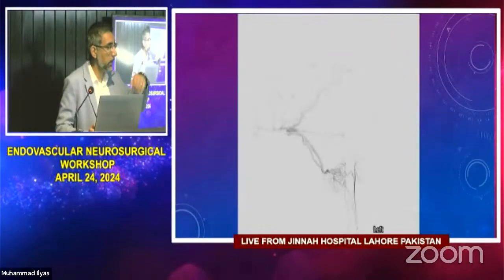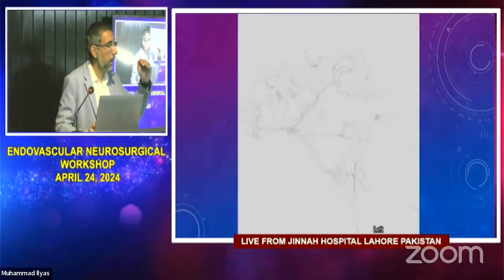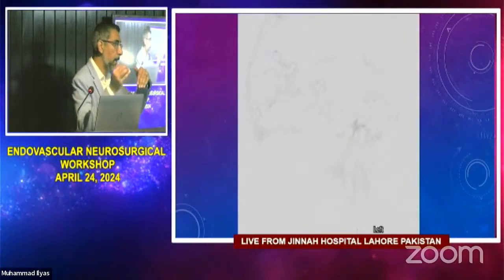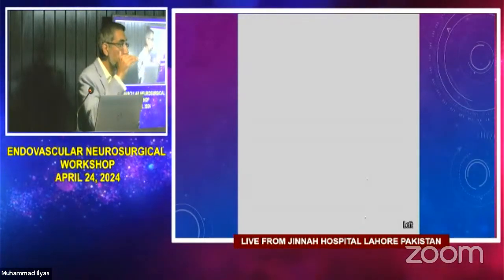The Onyx in the fistula side, in the sigmoid sinus, and I worked my way back until I got to the areas where both the ascending pharyngeal was supplying and the middle. So the middle meningeal and ascending pharyngeal were supplying two different parts of the sigmoid sinus. So there were two different fistulous points.